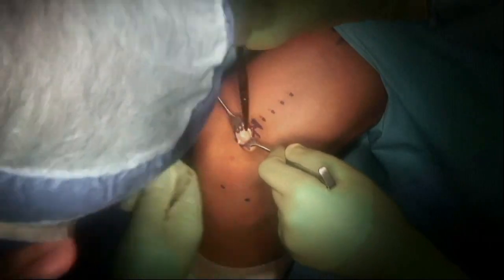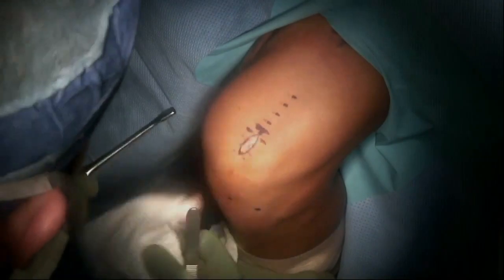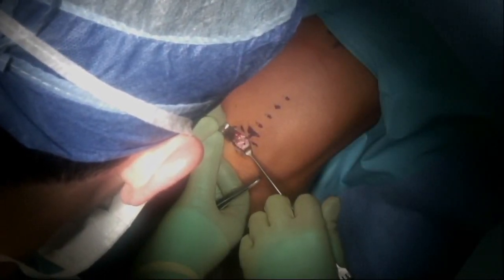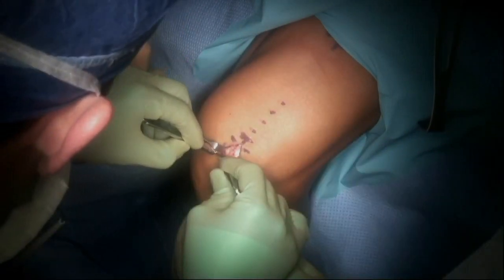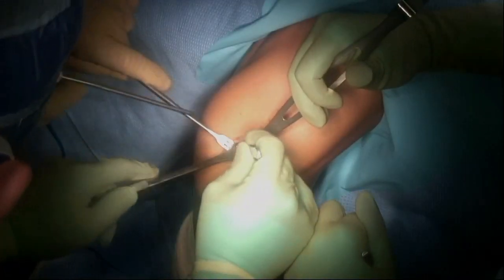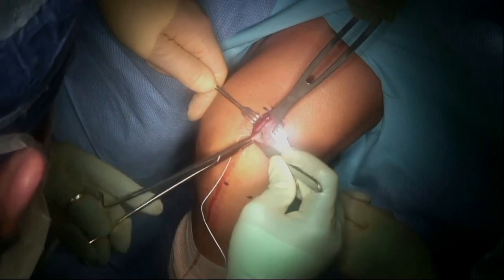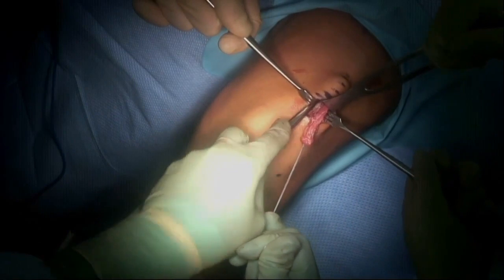In this video we can see harvest of a quadriceps tendon autograft. There is a minimally invasive approach using endoscopic harvest — the knee is placed in 90 degrees of flexion, and a 2.5 to 3cm transverse skin incision is made over the superior border of the patella. The prepatellar bursa is incised longitudinally and the quadriceps tendon is carefully exposed. A tendon separator is used to determine the thickness of the graft, which is generally around 5mm. The knife is pushed proximal to the same mark, the tendon strip is cut subcutaneously by a special tendon cutter, and the graft is retrieved through the skin incision. A measurement is then taken to ensure appropriate graft length.